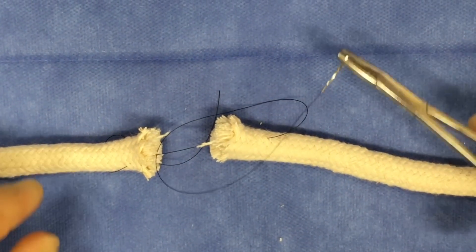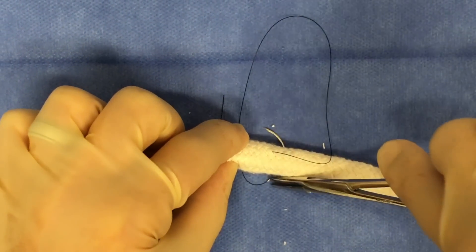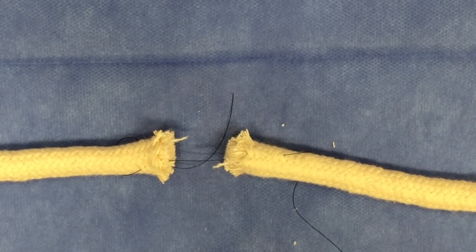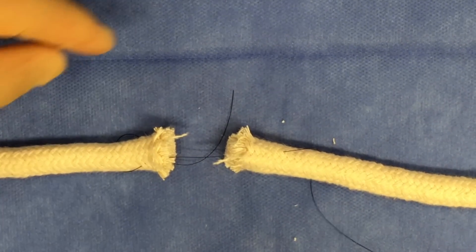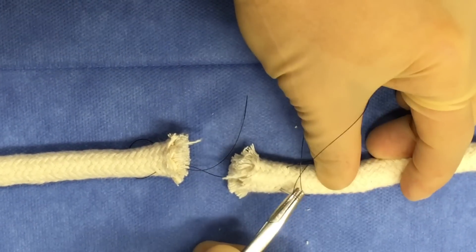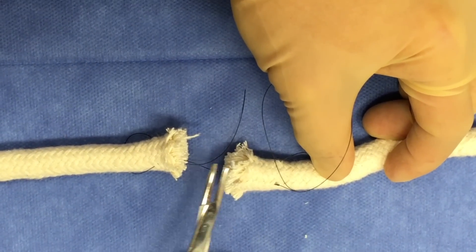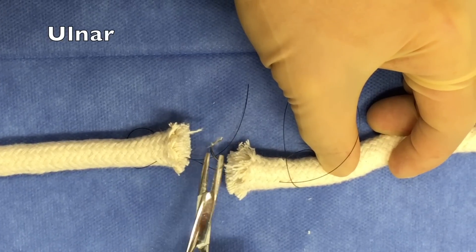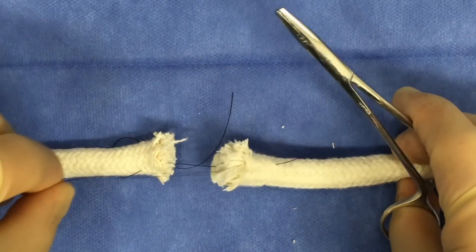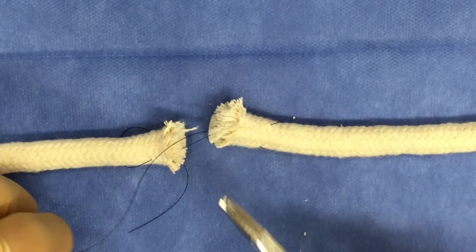Instead of continuing on to the radial side of the other cut end of the tendon, you're going to make a type of X shape and cross back over to the ulnar side of the tendon as you enter through the cut edge and exit through the dorsal surface of the tendon. You'll then again pass the suture behind the tendon, or suture through the tendon itself. This time you'll enter through the dorsal surface on the radial side of the tendon and crisscross as you exit through the cut end, coming out to meet the suture end on the ulnar side. When you finally tie this off, you're going to get that familiar figure of eight shape within the tendon itself, rather than the rectangular mattress suture pattern.